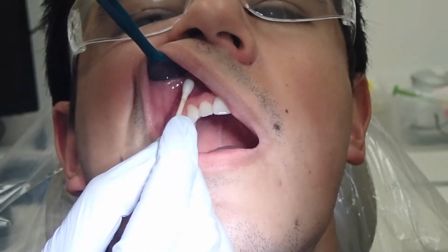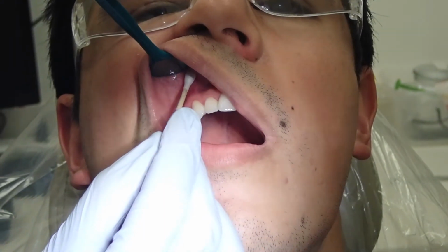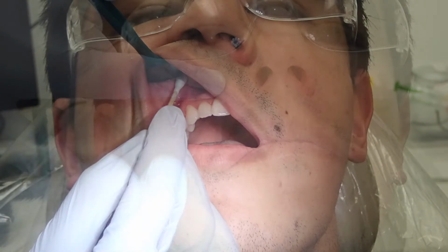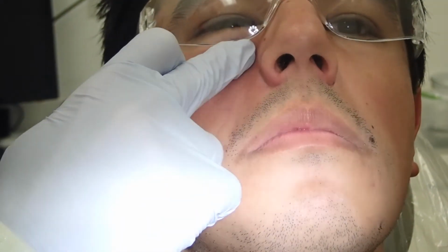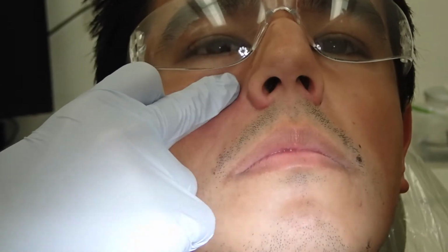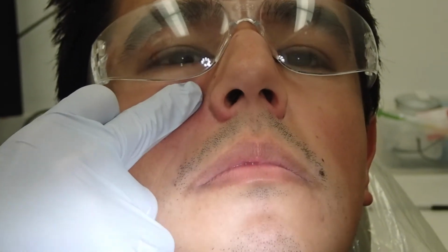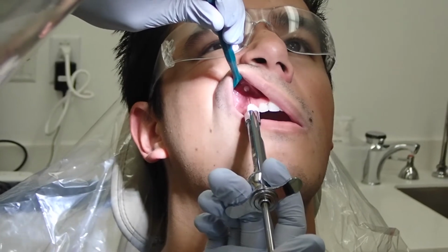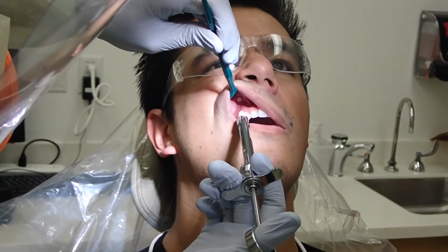The intraoral anatomical landmarks for the ASA are the middle of the canine and the height of the vestibule. The infraorbital notch serves as a directional target you can orient your needle towards and can be palpated extraorally. Never insert the needle in an attempt to reach the infraorbital notch. The notch is not your target. The recommended needle length for this injection is a short 25 millimeter needle, and your depth of penetration should never exceed 1/2 of the needle's total length.